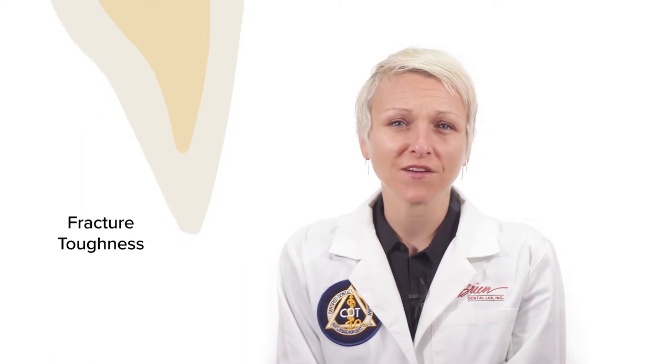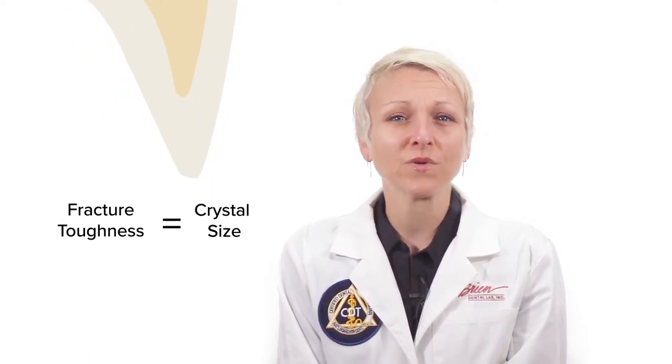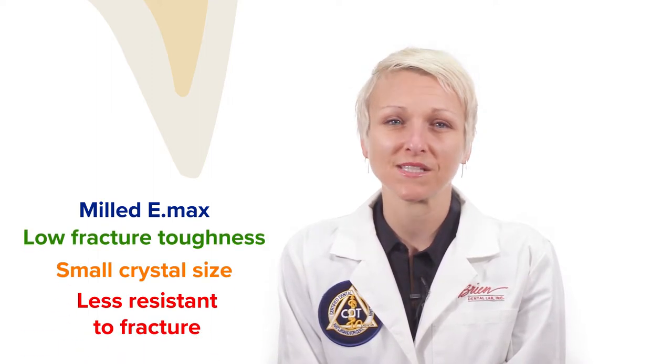Fracture toughness is the ability of a material to resist surface fractures. Since a surface fracture will continue to propagate through the material, the goal is to avoid them in the first place. That's why a higher fracture toughness is important for the occlusal surface. The fracture toughness is based on the size and formation of the crystals. The reason that milled Emax has a lower fracture toughness is because the crystals are smaller and therefore less resistant to fracture.